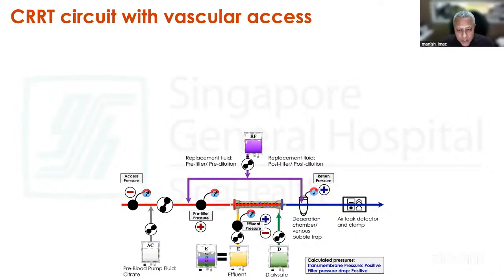So for the performance of CRRT, we are very familiar with this extracorporeal function of the CRRT machine, wherein we know that we have a blood flow, then the blood flow is passed through a hemofilter, and then we have certain flow rates of dialysate and replacement fluid and anticoagulation running. We fix up a very nice dose of CRRT. We've planned our anticoagulation strategies. But the most important part of CRRT is this.